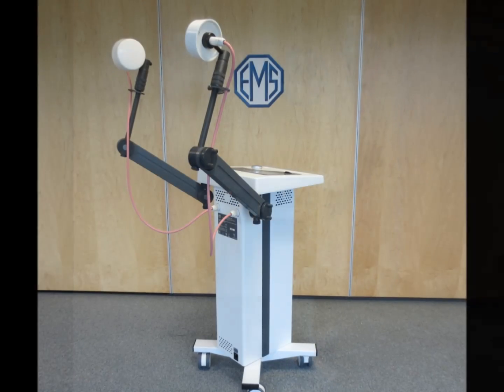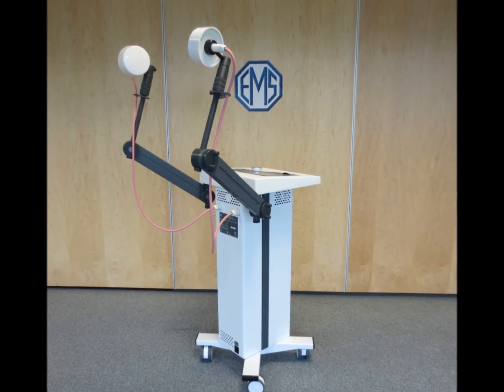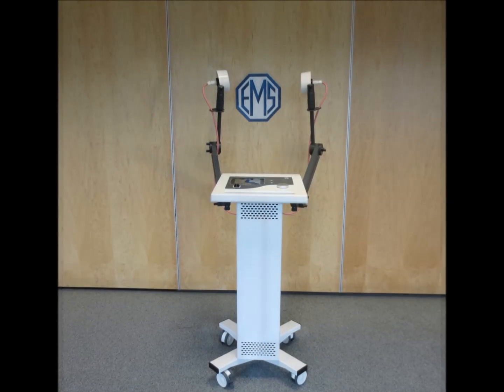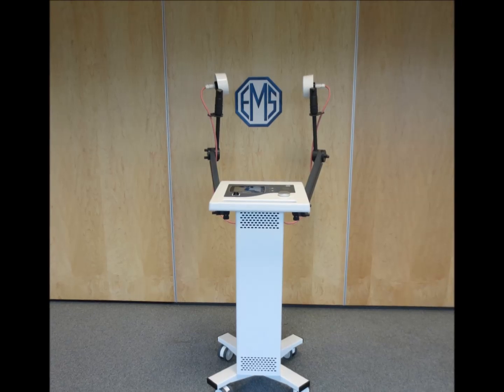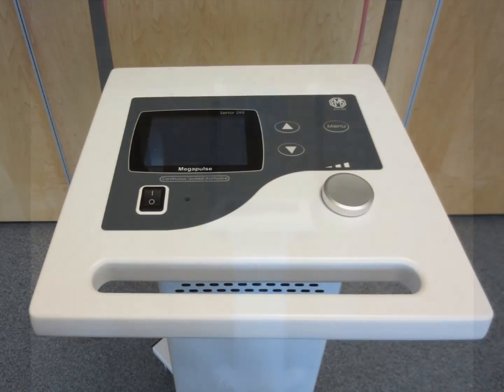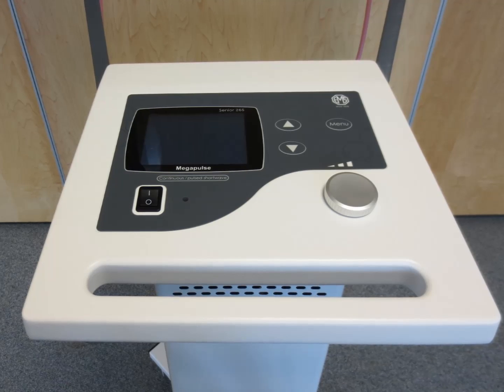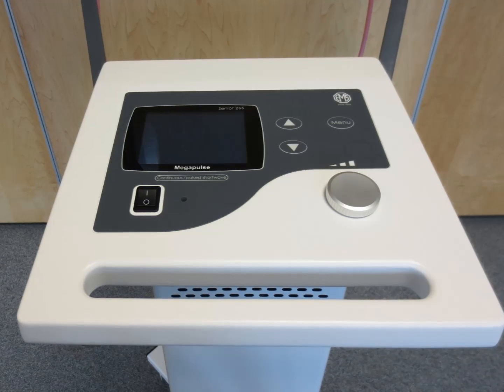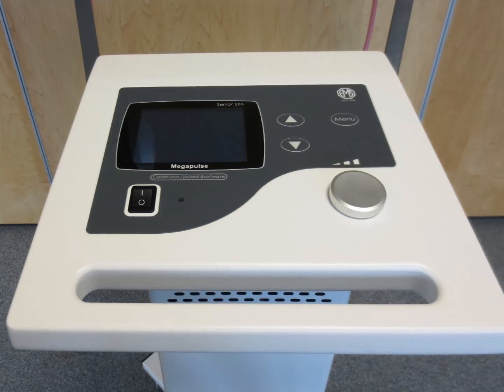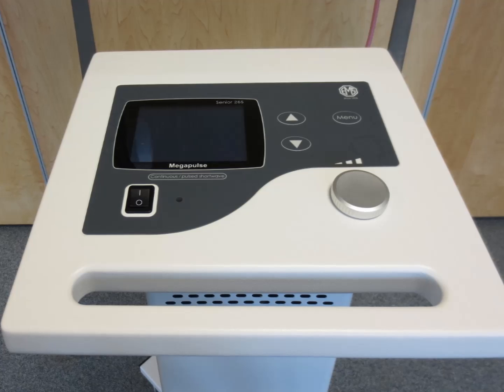The unit itself has an elegant and contemporary design and will fit easily into all types of physical therapy clinics, both new and established. It has been designed to be easily moved from room to room without causing strain to the operator. The integrated handle at the front allows for the most ergonomic handling of the device, while also keeping it safe from accidental damage.